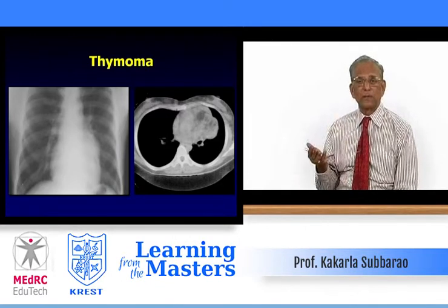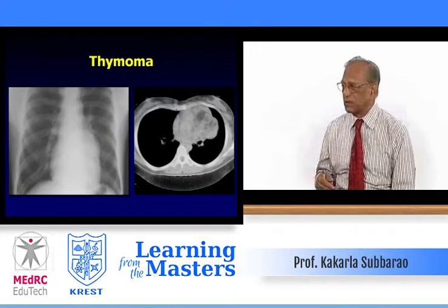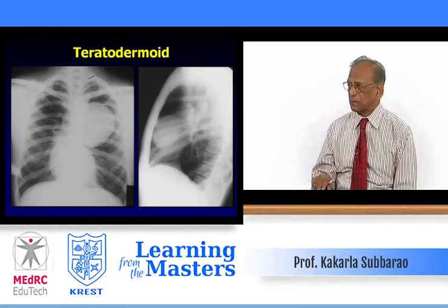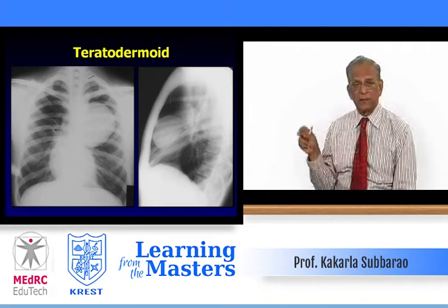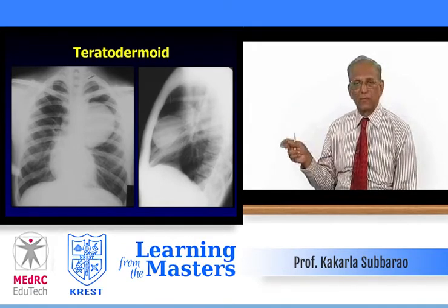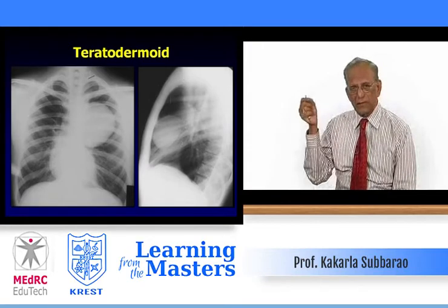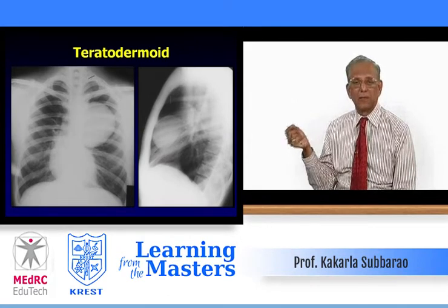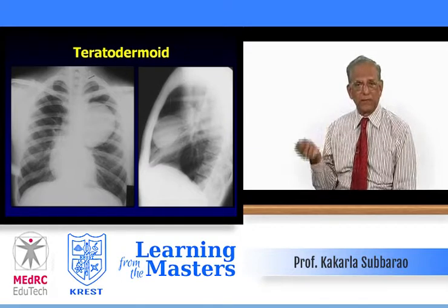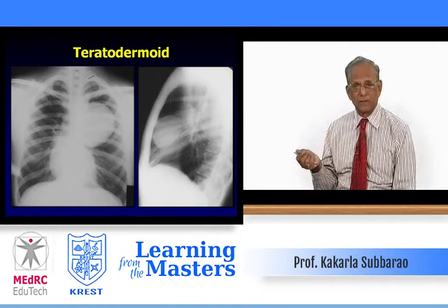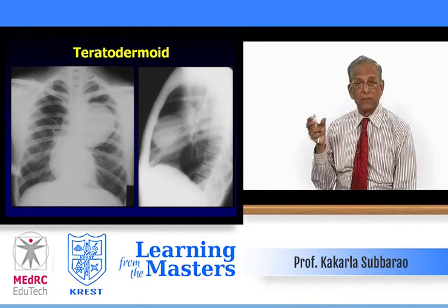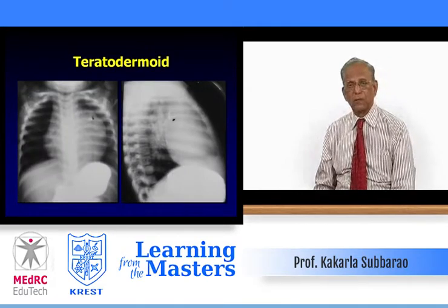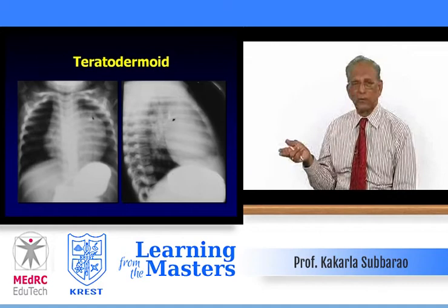But you don't know the structure of that tumor, so you take a CT — there is a mass with several areas of necrosis, and this is thymoma. In another case, a well-circumscribed mass still in the anterior mediastinum: the lateral view shows a characteristic density around the margin. This indicates it is a teratodermoid, but we take a CT to find calcifications, teeth, bones, sebaceous material, or sebaceous balls. Another teratodermoid — look at the calcification in the lateral view; it must be a teratodermoid.